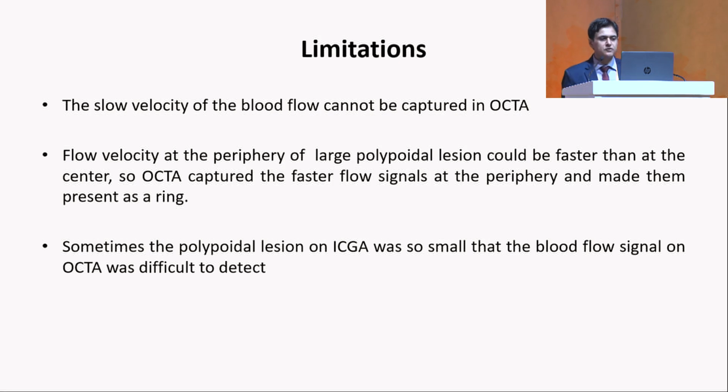As I said, the slow velocity of the blood is not captured on the OCTA, and at the periphery of the large polypoidal lesions the blood flow is faster, and hence they present as a complete ring or a half ring. Most of the time I feel it is very difficult to pick up a polyp on an OCTA.